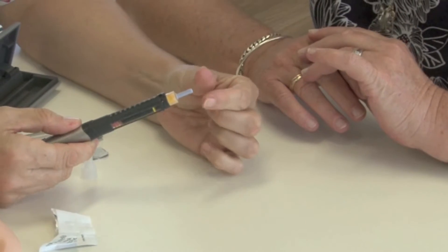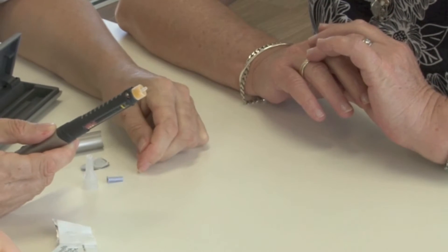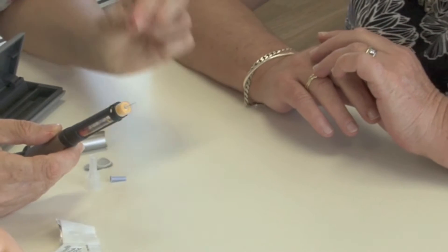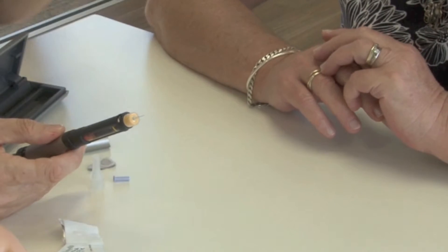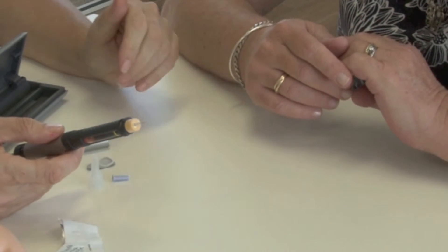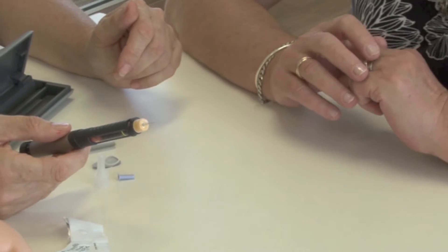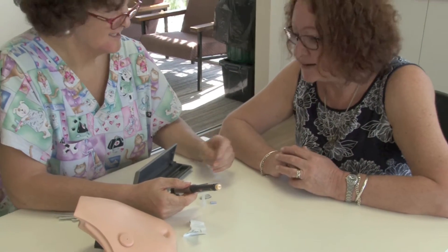We're going to take the end off — just remember there's something really sharp under there. It's very long, isn't it? It's only going to go into your subcutaneous tissue — do you remember? The tissue just under the skin. Oh yes, I remember that now. The diabetic nurse told me about this when I was in hospital, but it was a lot to take in — it was a little bit fuzzy.